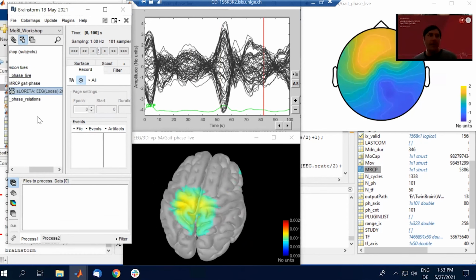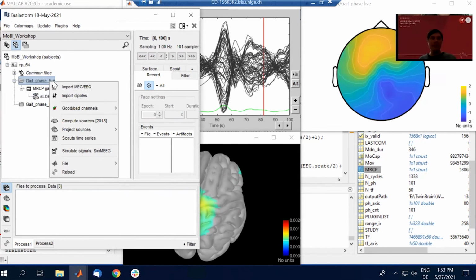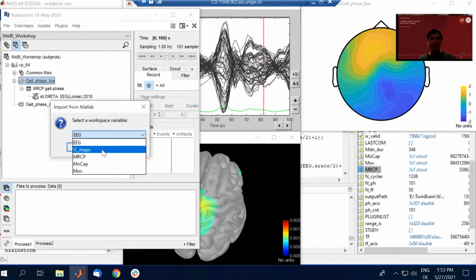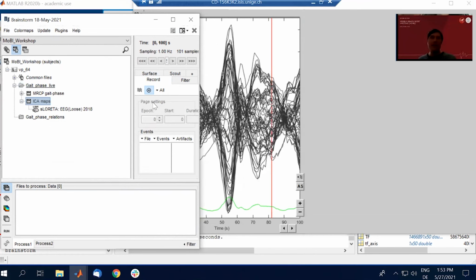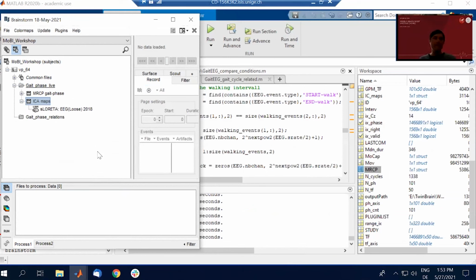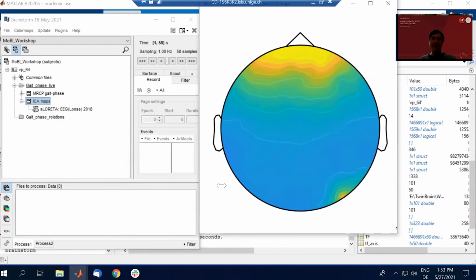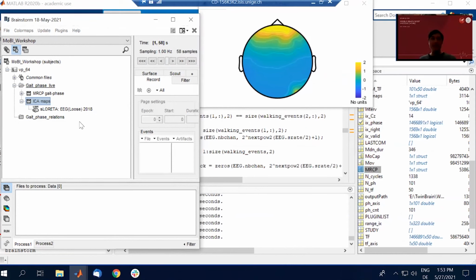That's the first example. I just do a second example where I'm not only loading these MRCPs, but I'm also loading from MATLAB the IC maps. That's very similar to what we did in EEGLAB already. I'm closing all those guys because this is what you learned already. You know about that. And that's very simple. This is just we can look again at the time. It doesn't make much sense because there is no time structure, but we can look at the maps. We can look at the disks. That must be exactly the same as we see in EEGLAB. It's just a different visualization.